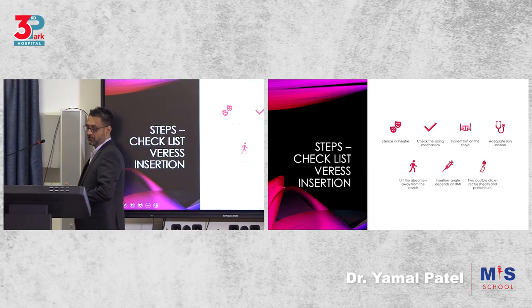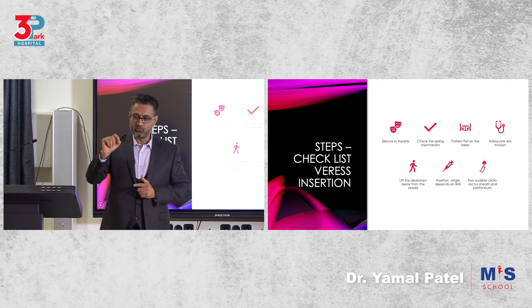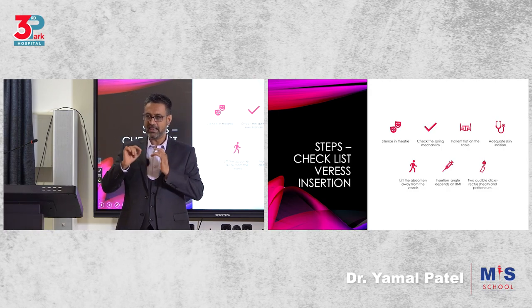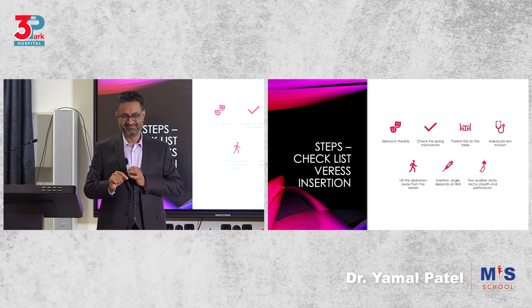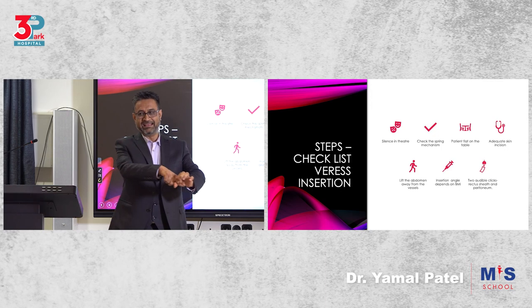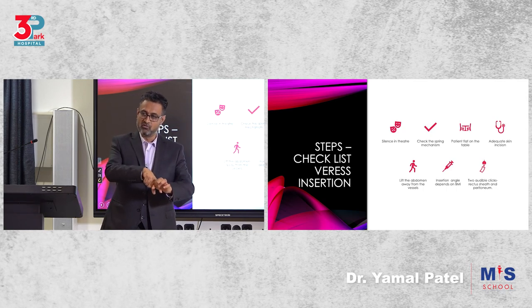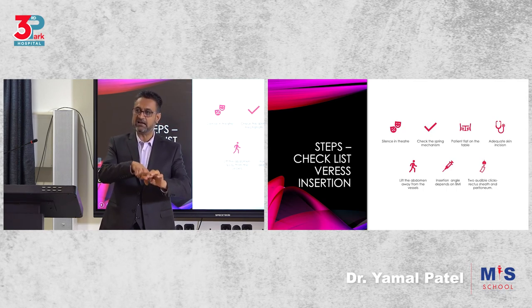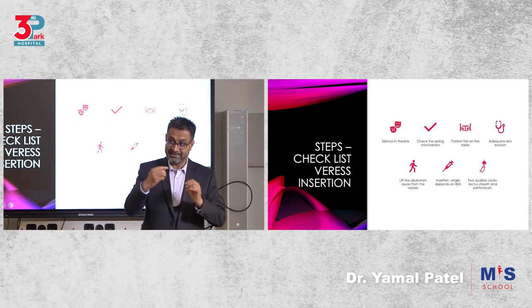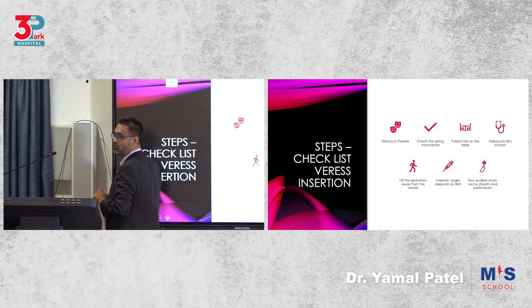So be careful. Then you're going to be listening for two audible clicks in those tissues which are non-elastic. There are two tissues in this layer that are non-elastic, which means you can't stretch them, so they are the ones that will cause the click. When you're going through fat, you won't get a click; it will slide. When you reach the rectus sheath, it's not elastic, so when it passes through, the spring action will come out and it will go tuck. Then you go further through muscle. When you reach the peritoneum, again, it's not stretchable, and you will feel a tuck. So you listen for these two clicks and you know you should be in.